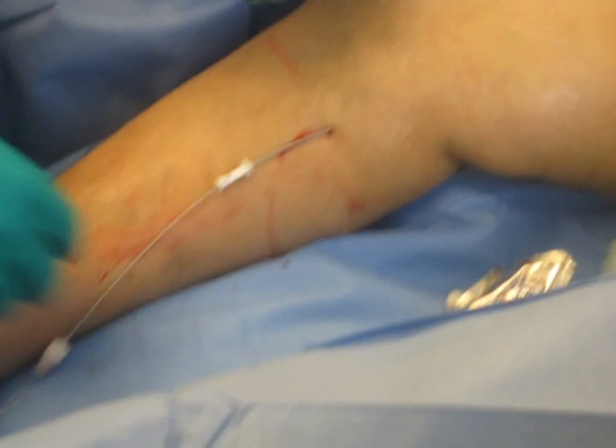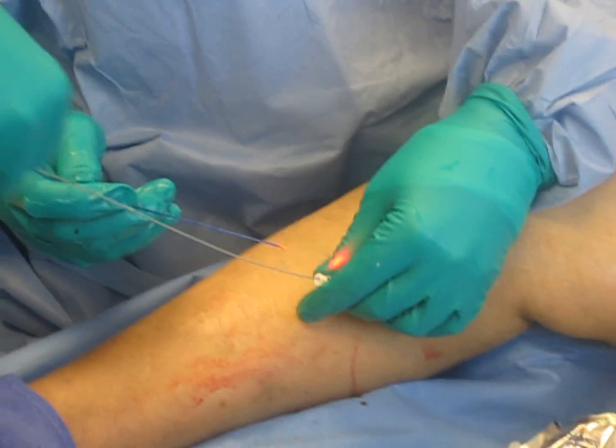You'll see me pulling back — that's her junction right there to your left, that's her terminal valve. And right here to her right you'll see me wiggling — it looks like there are two little fingers there — and it's right behind her subterminal valve. The subterminal valve is this little line right here, and my laser's right here. We're going to insert the laser fiber on the inside of this catheter.